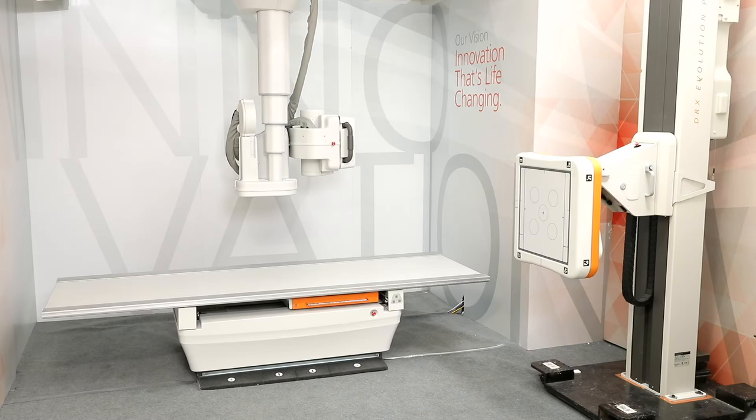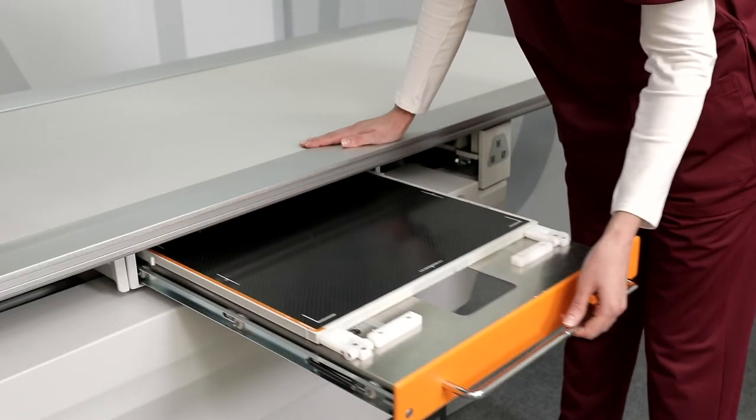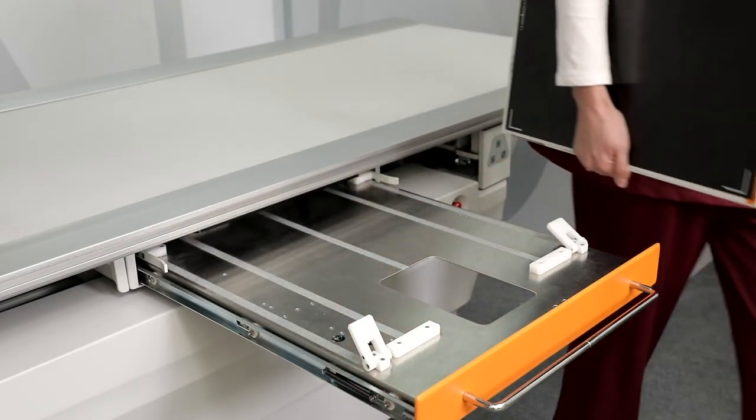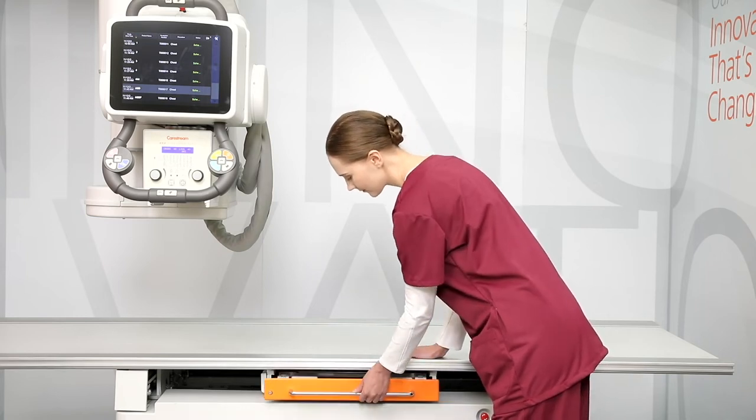The table goes very low to the floor to accommodate pediatrics and patients in wheelchairs. To protect your detector investment while in the optional rotating bucky, the detector can be positioned from landscape to portrait. Also, the detector automatically charges while in the table.